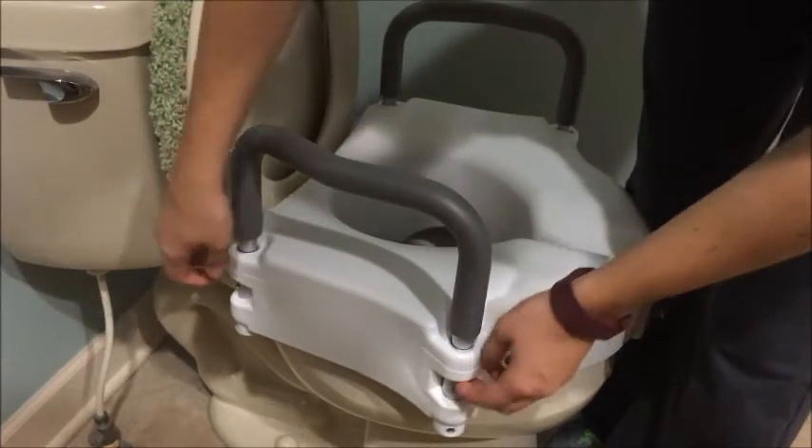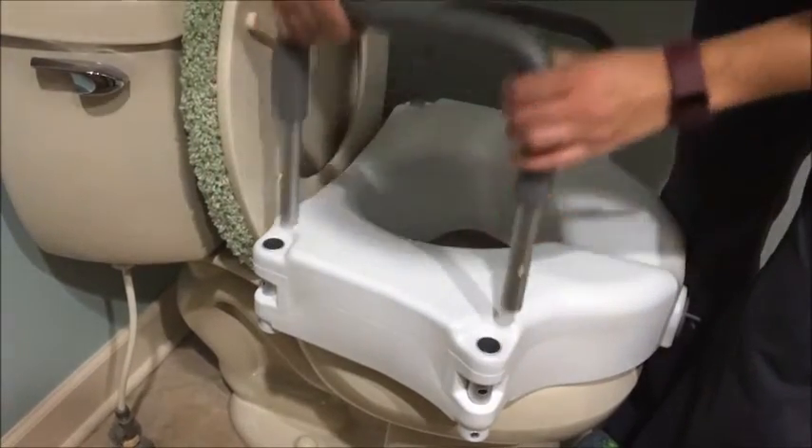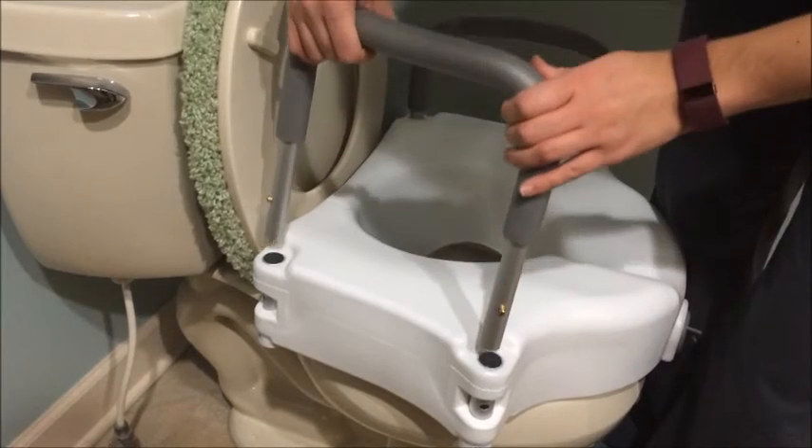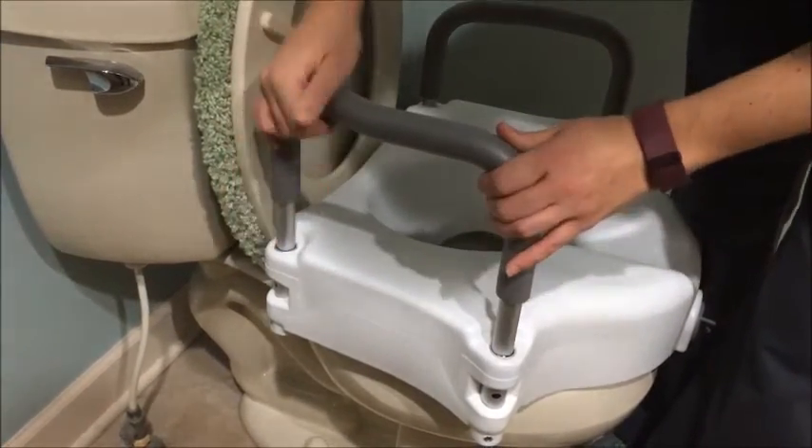Remove the optional armrests by pressing in the pins located on the side of the armrests. Lift the armrests up and out. To install the armrests, press the pins while inserting the armrests into the armrest slots on the raised toilet seat.